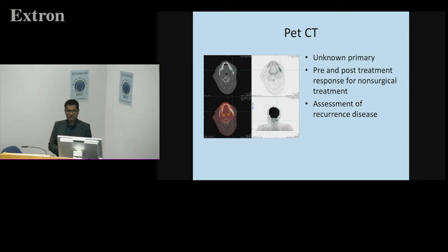PET-CT, obviously, the standard is for investigating unknown primary, but also pre and post treatment for non-surgical treatment. So that's what we tend to do in our MDT, and also recurrence. Yeah? So those are the areas where you tend to get a PET-CT scan.